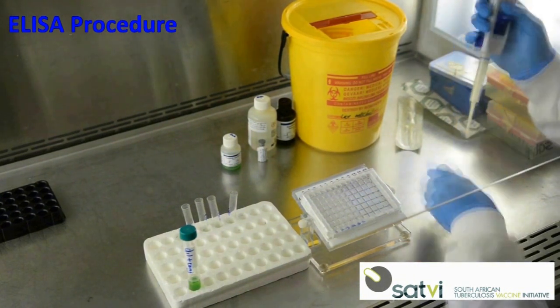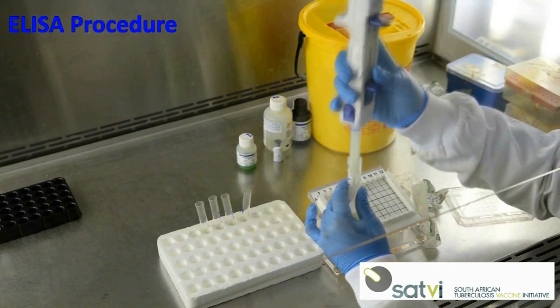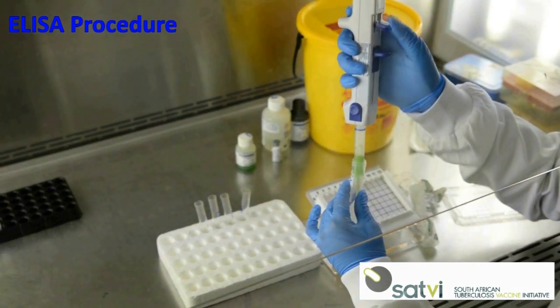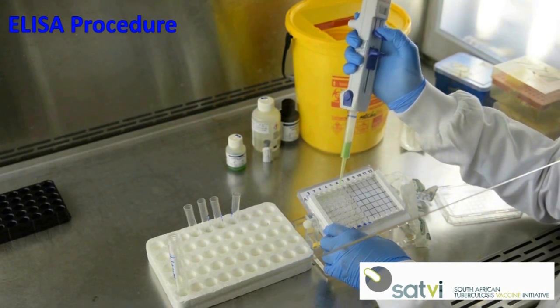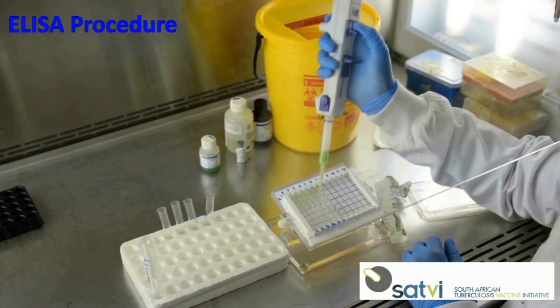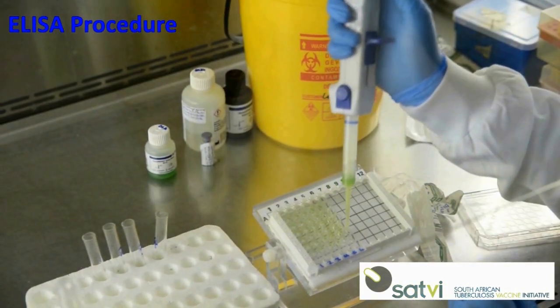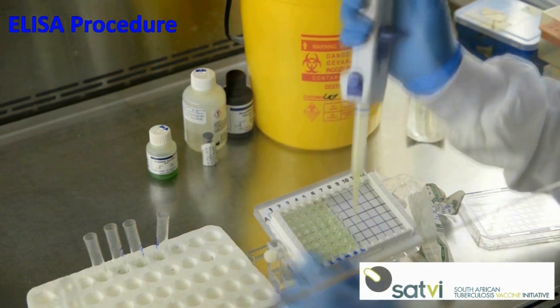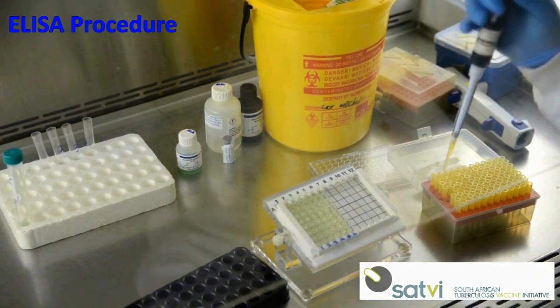Add 50 microliters of the working strength conjugate to each well. Add 50 microliters of the test plasma to the assigned wells on the plate.